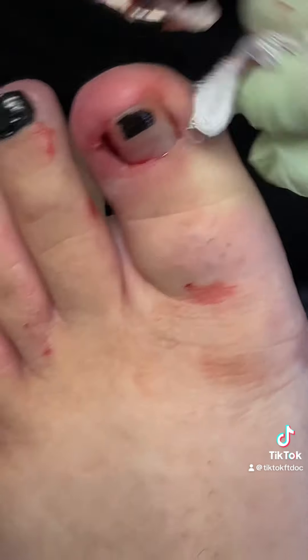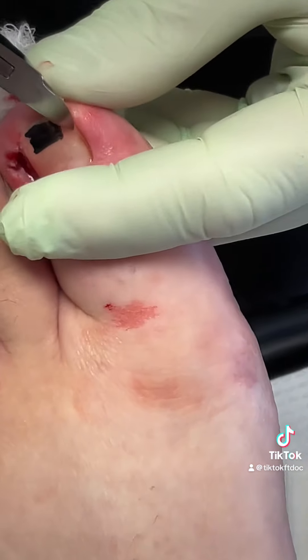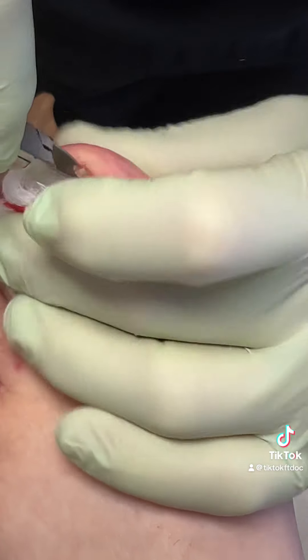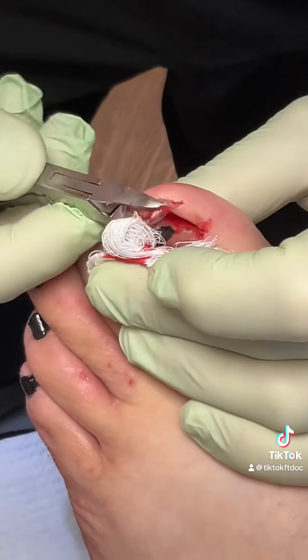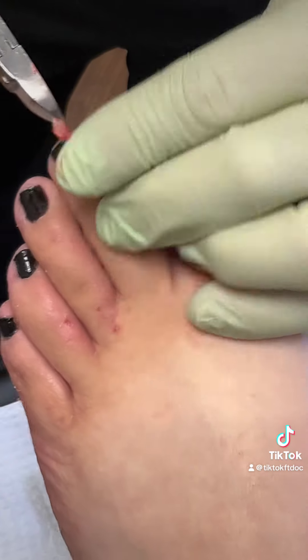Cut that corner out, and this corner is kind of digging in there as well. Once again, thank goodness for local anesthesia. We're going to remove that skin as well. Here's the other piece that we took out on that one side — pretty big.